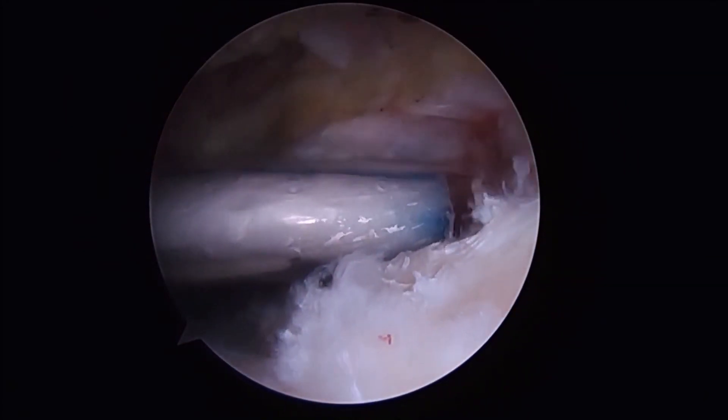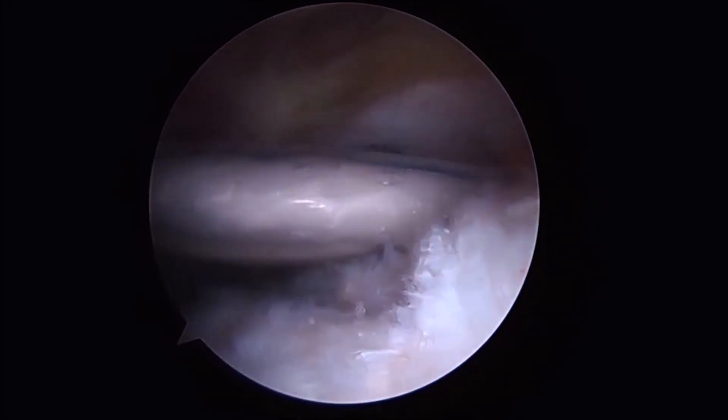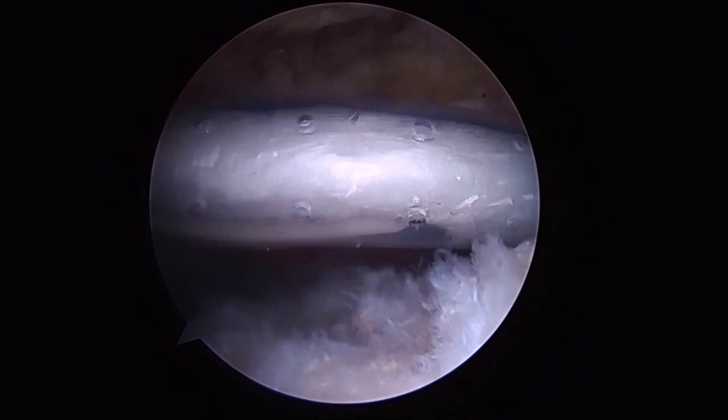The graft is then introduced on the loader and we make sure that we have adequate coverage from anterior to posterior as well as medial to lateral. At this point the graft can be unfurled and placed into position.